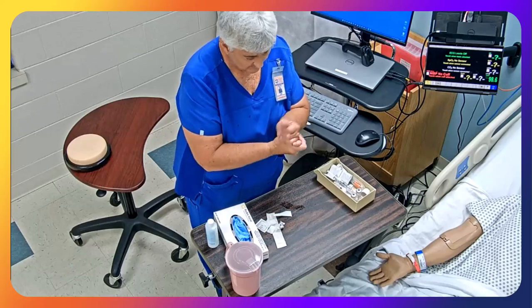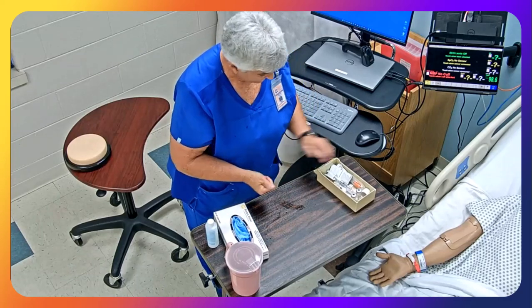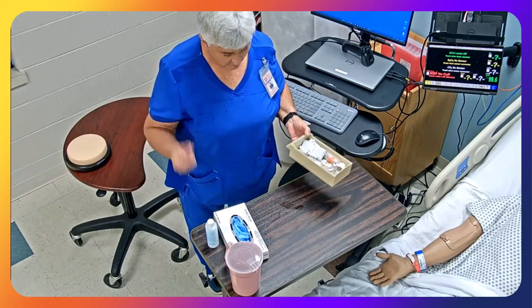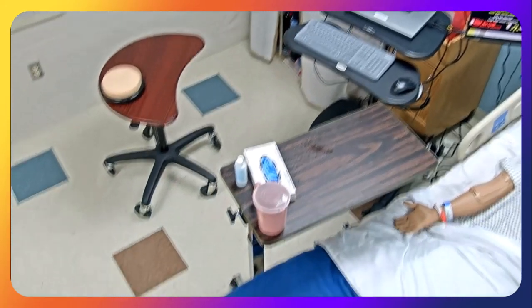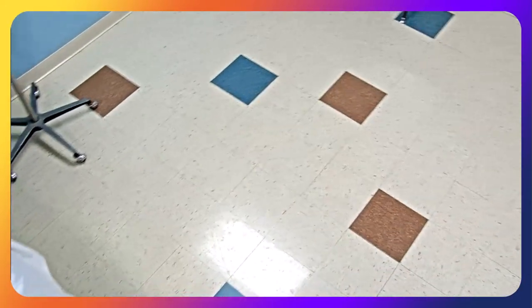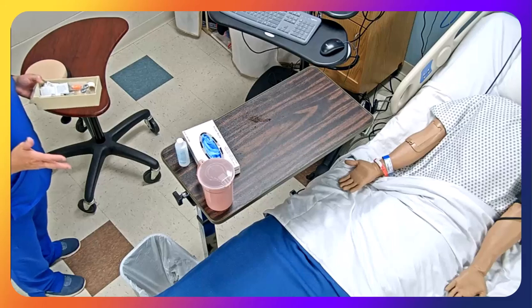Leave my extra there. I'm going to get all my trash, and I didn't need gloves because I wasn't touching the medication. So as I'm going to leave the med room and take my trash, I'm going to go to the patient's room.